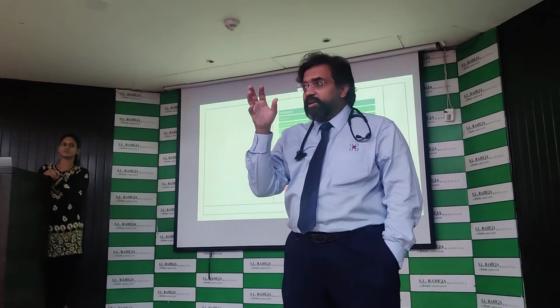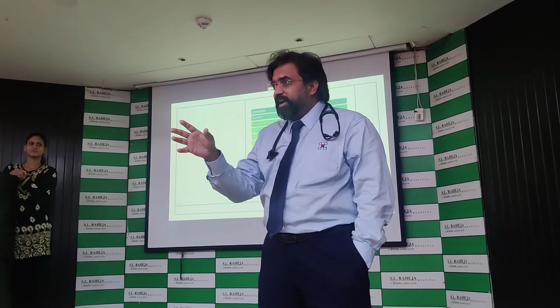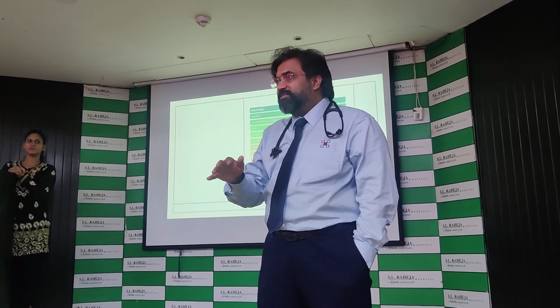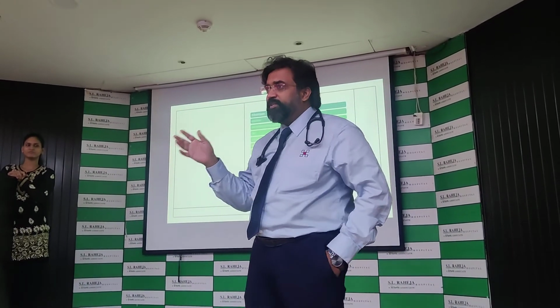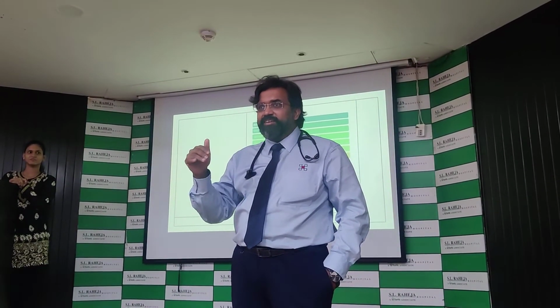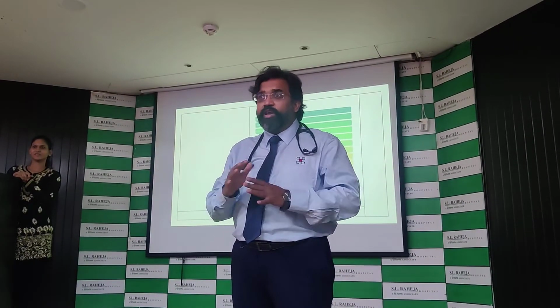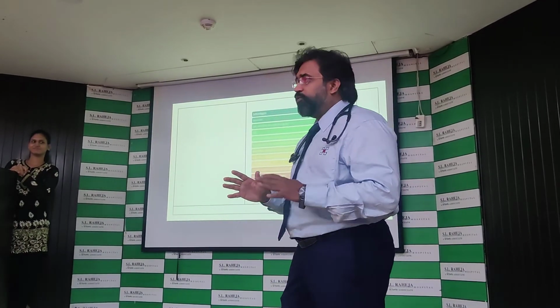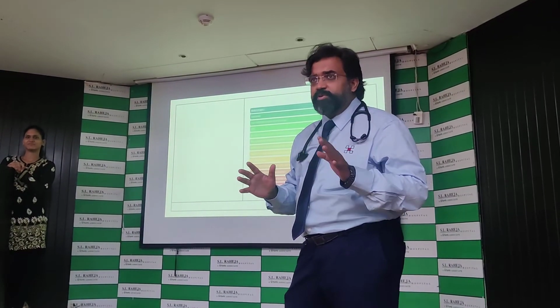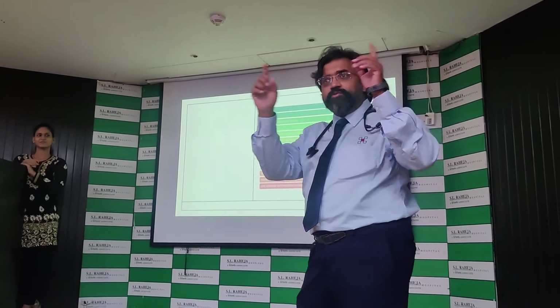If there is electrical impedance tomography that we've been doing, what will we realize? That this PEEP is adequate or not. Or whether it's causing overdistension or not. You got the point. So if this is coupled with an EIT, it will become like the best thing in the world to ventilate with. Full artificial intelligence, nothing to be worried about. Full knowledge base. It will become perfect. So imagine we have this ASV and then we are using the EIT belt.